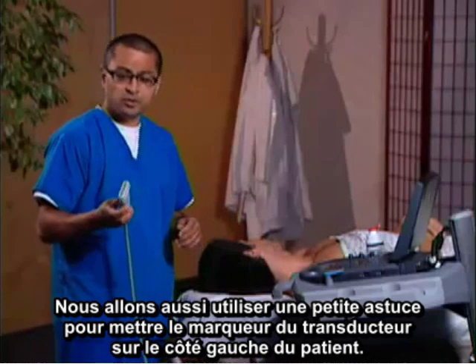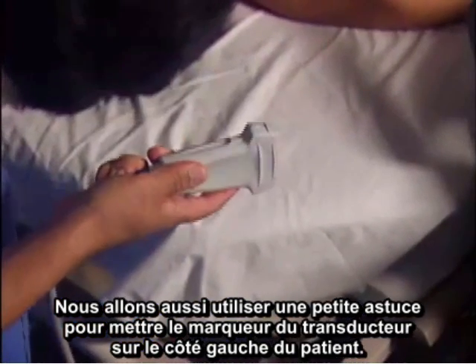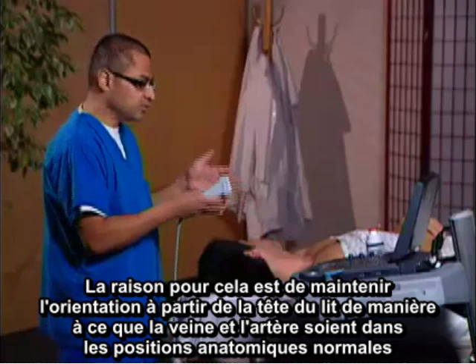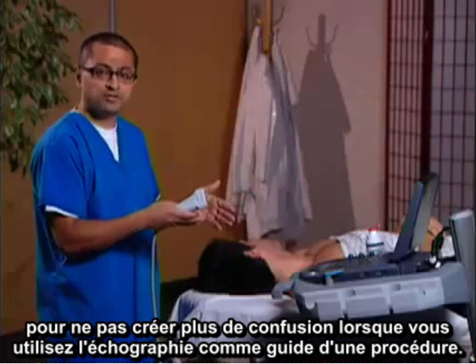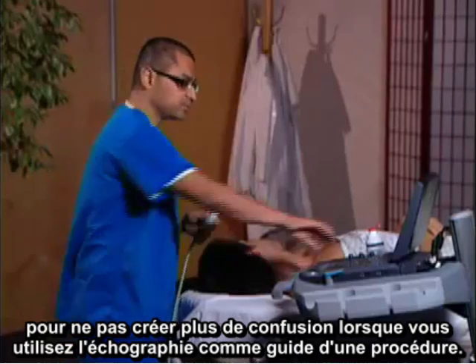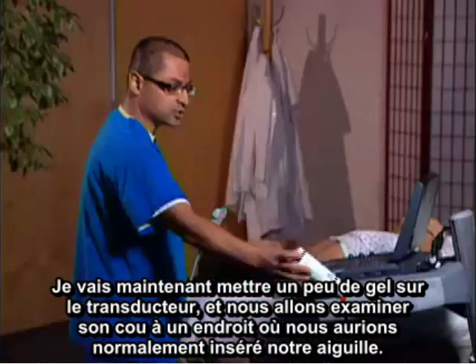We're going to also use a little trick to put the transducer marker actually to the patient's left. The reason I do this is to maintain the orientation from the head of the bed so the vein and the artery are in the normal anatomic positions, so it's not to create more confusion when you're using ultrasound for guidance of a procedure. I'm going to go ahead and put a little bit of gel on this transducer.